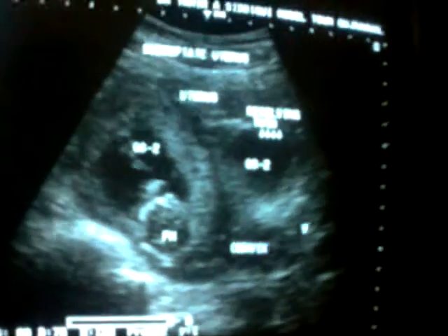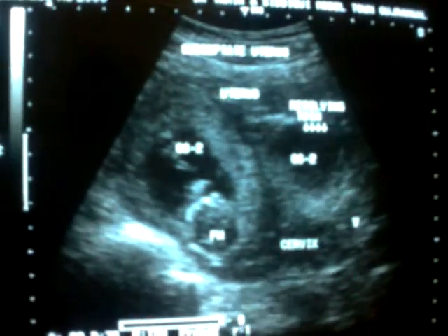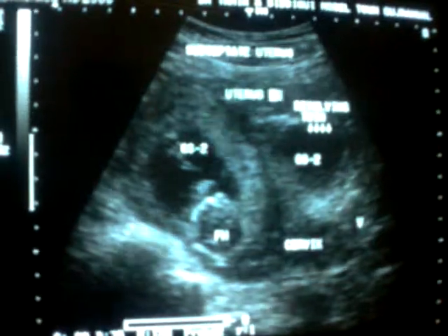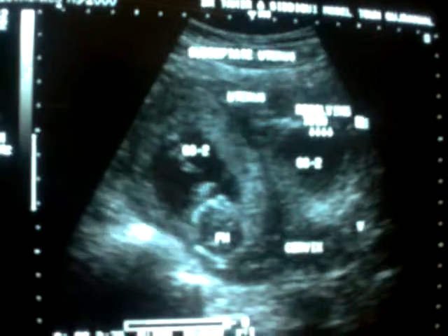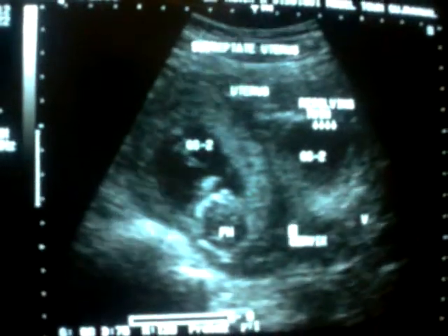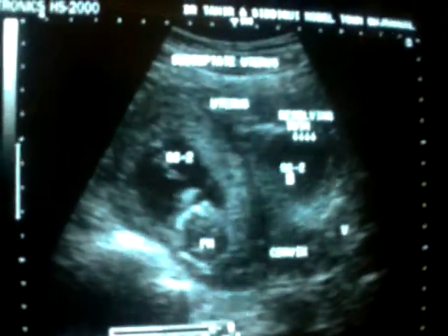I have uploaded a few segments of subseptate uterus as well as bicornuate uterus. If you study those, you will come across these things very clearly. Now see, this is the myometrium. This area is the myometrium. A single cervix is important to note. A single vagina is important to note. This is not a double uterus. This is a subseptate uterus, separated, and both are separated.